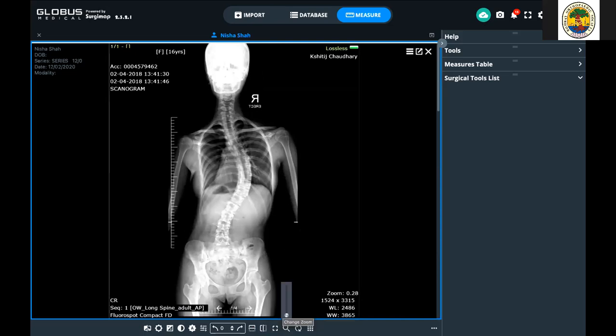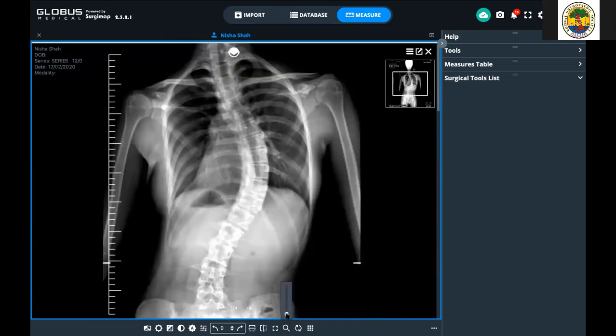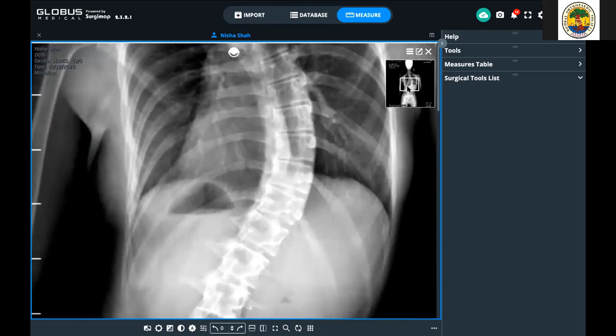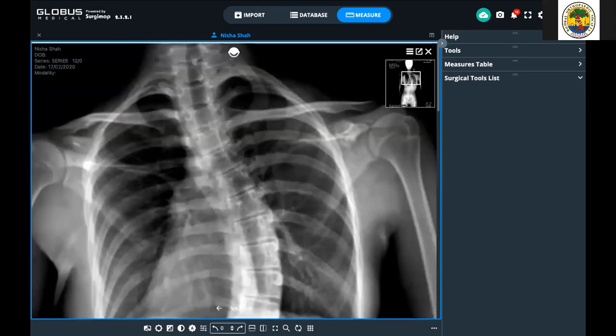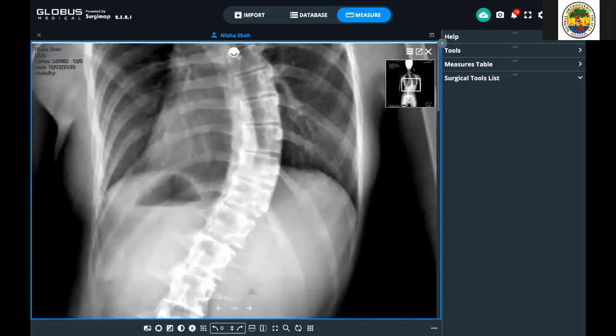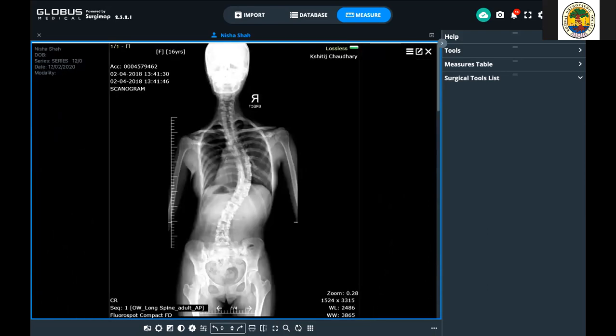So now another important function is the change zoom, where you can zoom the image up and down, and for you to pan the areas, you go to this mini map here and then move the mini map to wherever you want to see it. So this minimap moves the zoomed image to where you want to see it. Okay. And if you want to quickly zoom out, then click the button next to the lens and it will quickly go back to its old position.